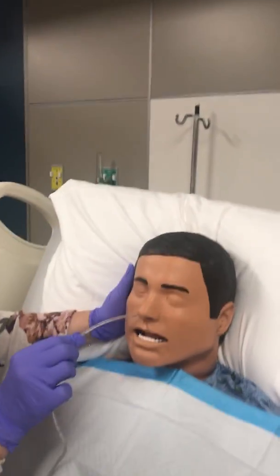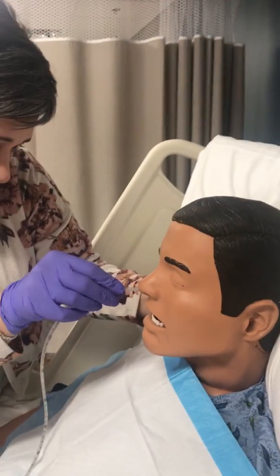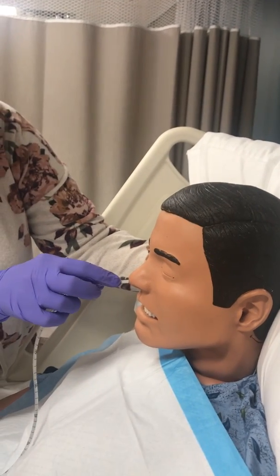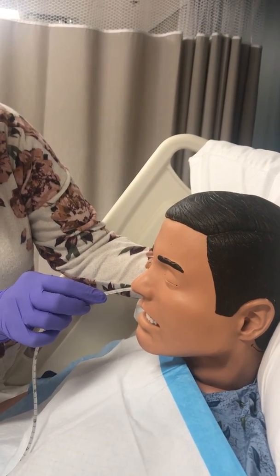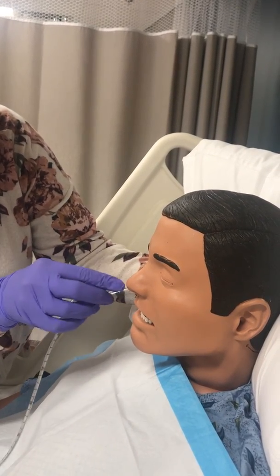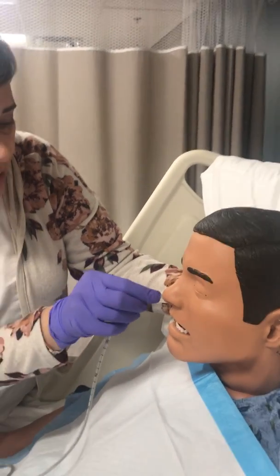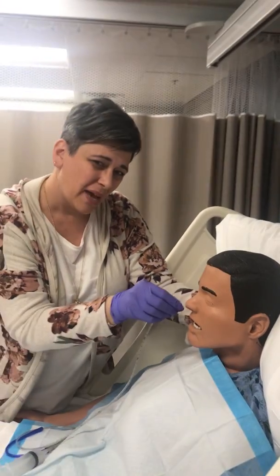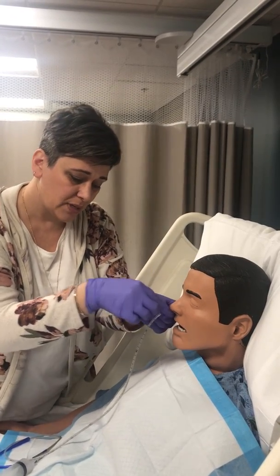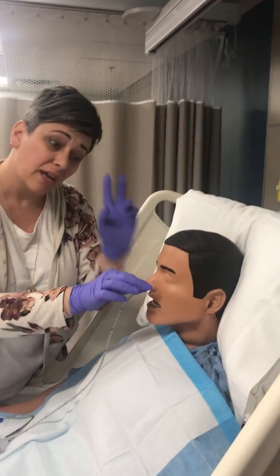Here we go, Helen. Straight in towards the ear. It reaches the nasal pharynx. Okay Helen, put your head down a little bit. Take a sip of water or not. Every time she swallows, I'm going to feel the tube go in and assist it a couple of inches each time. Good job. Swallows again — I'm going to push it in a little bit more. The mannequin does not let me put anything past this point, and that's okay — it's an issue with the mannequin we discussed. Even though my mark is further down, because it's a mannequin, I'm going to say I've reached my mark.